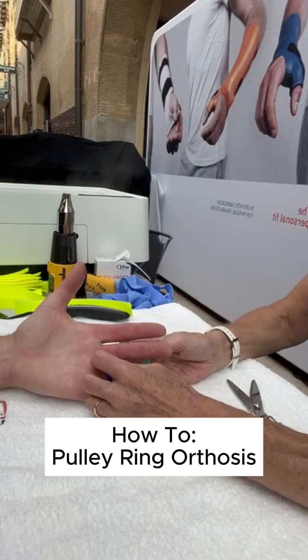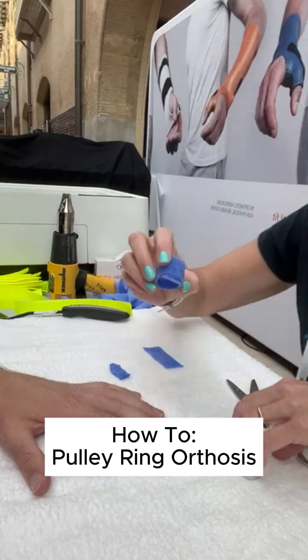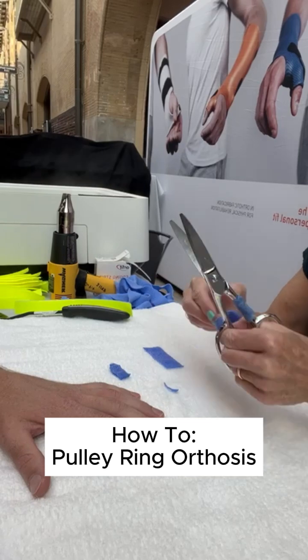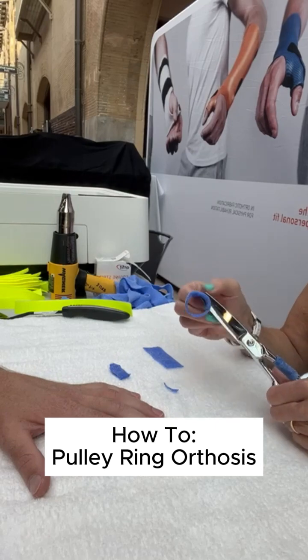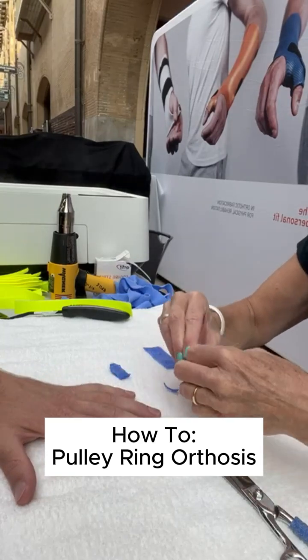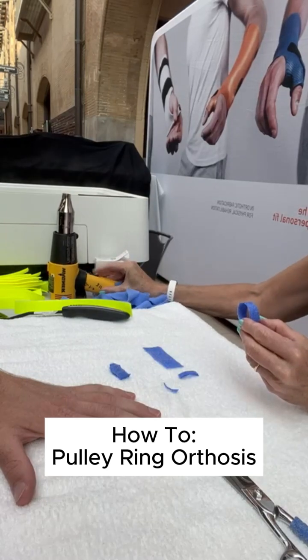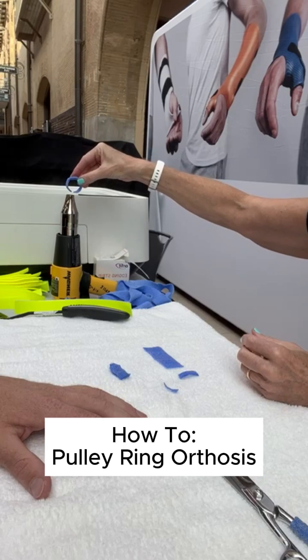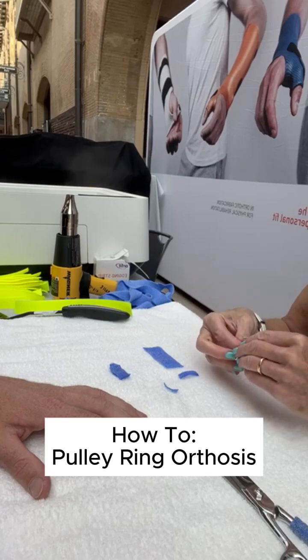So let's put this on and slide it off. I'm just going to break it in the back. I broke it open and then we're just going to heat it up and put it back together, so it will be a little weaker. You want it to break in the case of injury.